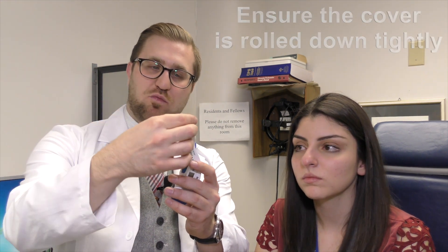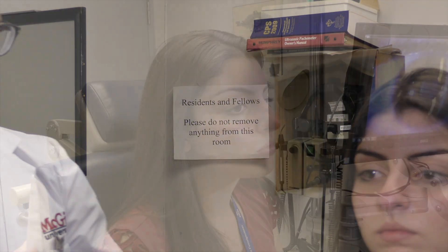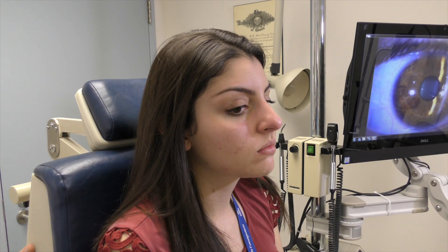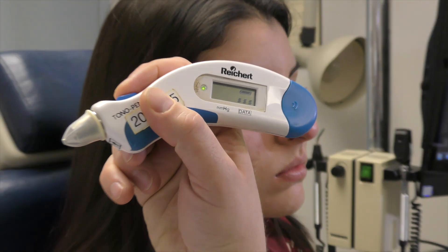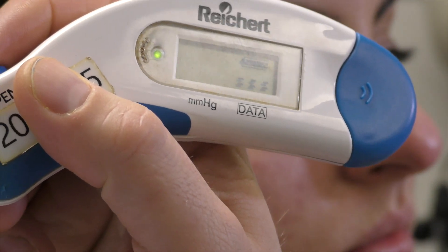Now we're ready to check the pressure. We wait about 10 to 20 seconds for the anesthetic drop to work. Once the eye is well frozen, I take out the tonopen. You can't check the pressure without putting a slip cover over the tip — we use these mini condoms. You place it on the tip and roll it down until it clicks in. Then I click the button, wait for the beep — green light means go, and the two lines confirm it's calibrated with a full battery charge. You're ready to go.